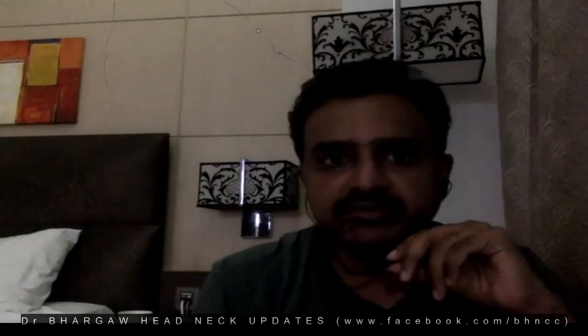Okay, sir. The next question is by Dr. Sriharsha, sir. At what time do you take the post-op scan? As a protocol, when we do a craniofacial resection, we do it on the first post-op day, to rule out pneumocephalus. That's the institute protocol. Especially when you do an open procedure, or a craniofacial resection, because some amount of air goes in as you do the procedure.